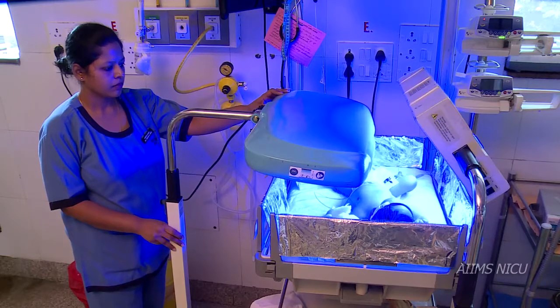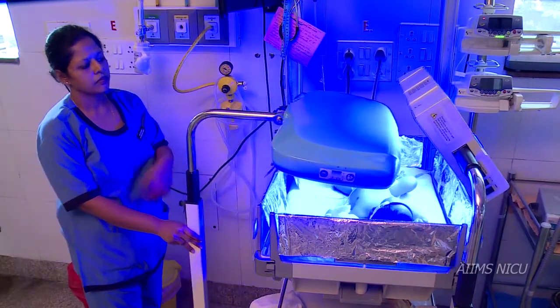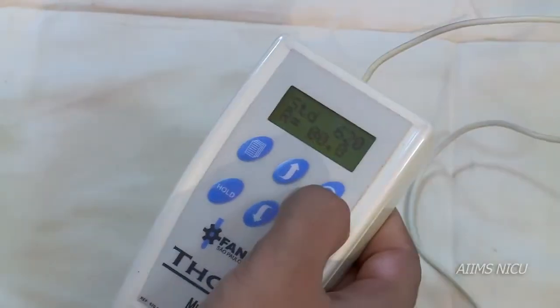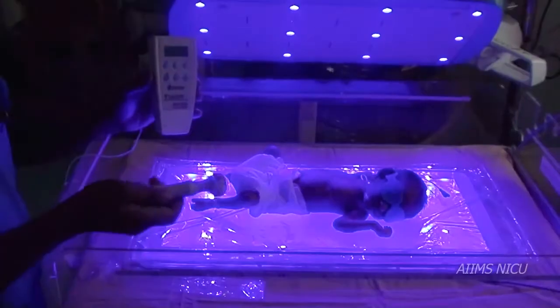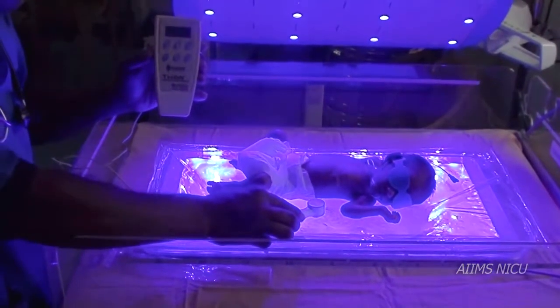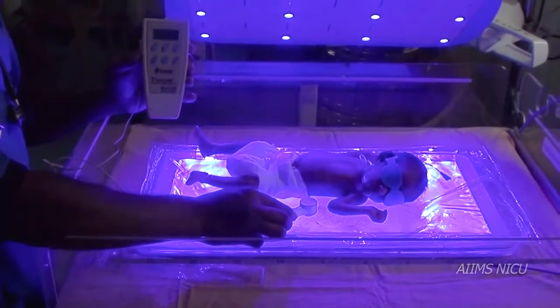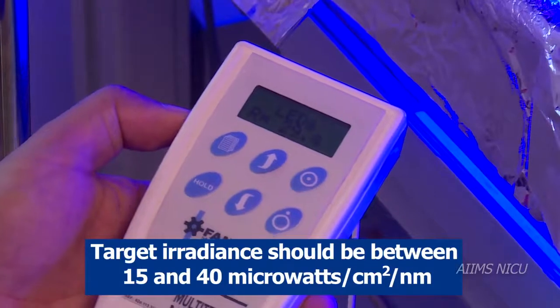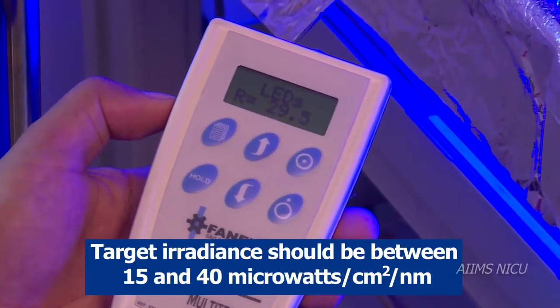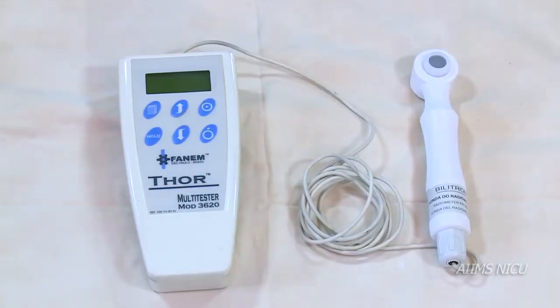In order to check irradiance, switch on the phototherapy unit from above and measure its irradiance. Then switch on the unit from below and measure irradiance by turning the sensor downwards. You can add both to get the total irradiance. The target irradiance is between 15 and 40 microwatts per centimeter square per nanometer.